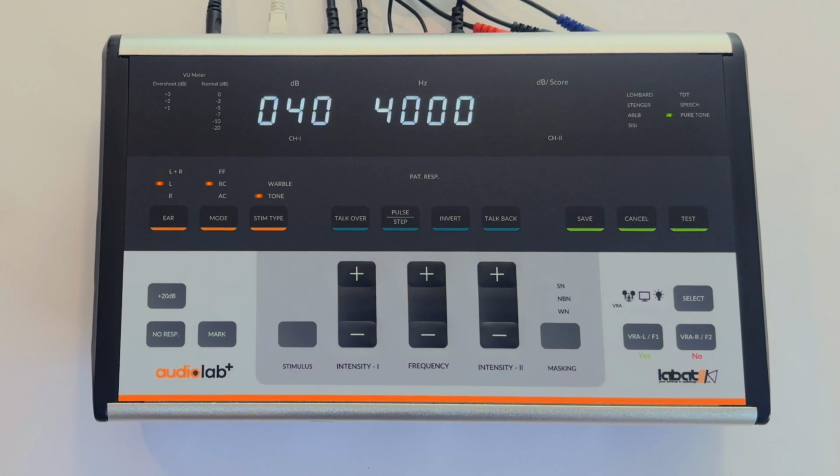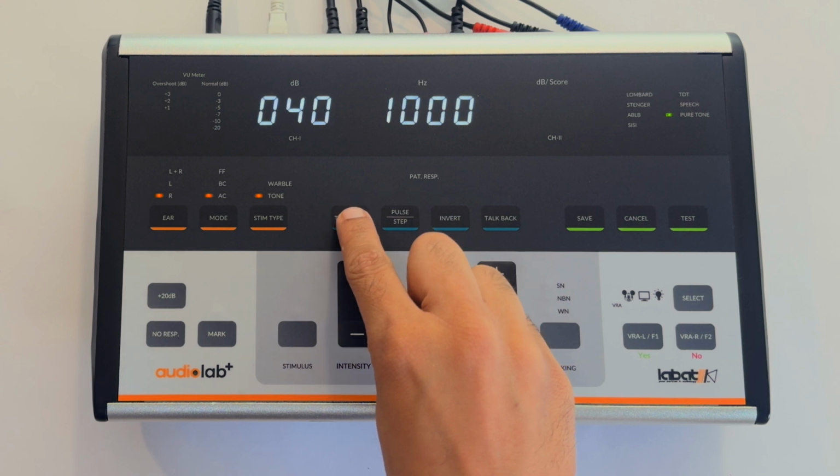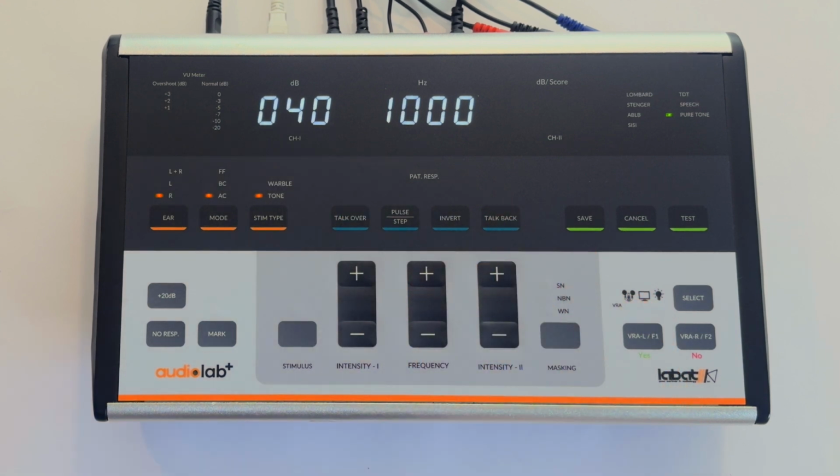Start with one ear. Provide stimulus across desired frequencies and mark responses accordingly. Then repeat bone conduction test for the other ear. This concludes AC and BC testing. To communicate with the patient, press Talk Over to speak and Talk Back to listen to the patient.